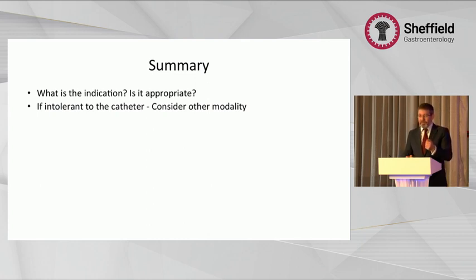If you find something like obstruction or spasm or aperistalsis and the patient is retching all over the place, that doesn't necessarily mean that's the problem. And we've seen lots of patients who've gone off and had myotomies and all sorts based on such a test. And so, of course, they don't respond well. Please only do physiology studies where recent endoscopy and or barium has been done by someone who knows what they're doing. Don't rely on a test 5 years ago. Don't rely on a test from who knows where.